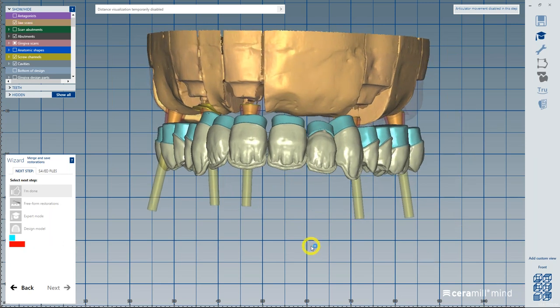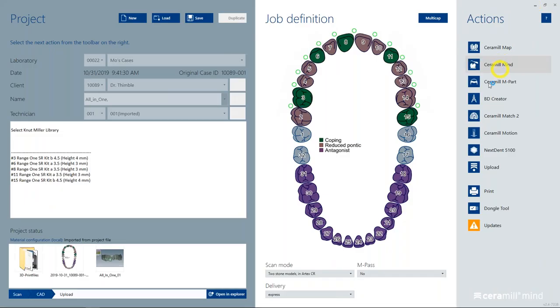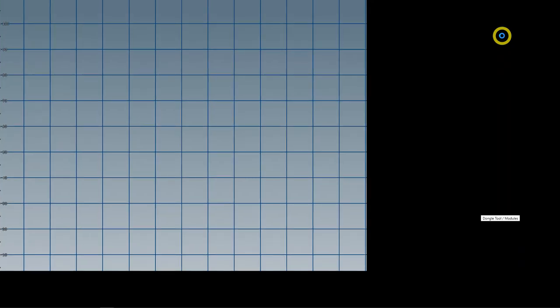And once this is complete merging, we'll bring this over into our CAM and we'll be able to mill the substructure and then mill the restorations of whatever material we decide. I should bring up the other one while this is merging. I'll do like the cooking show where I bring one up that I had prepared earlier. Also, while that's going, I guess we can discuss the modules right now as well.